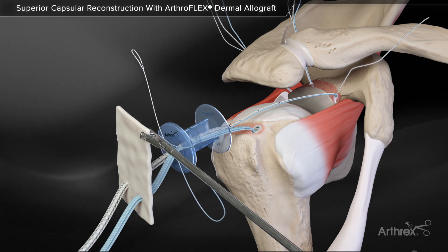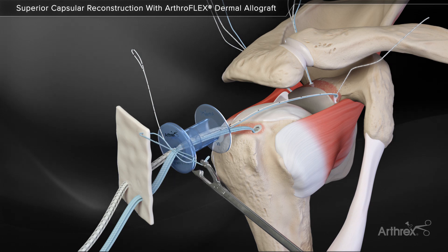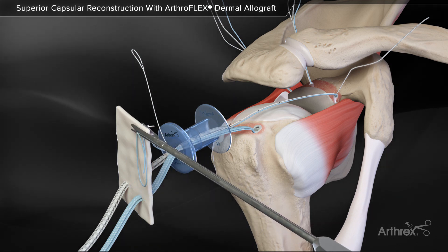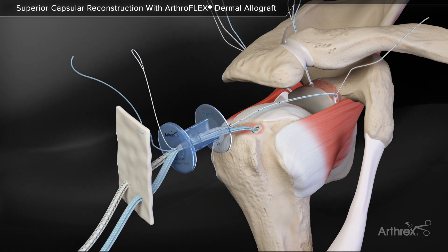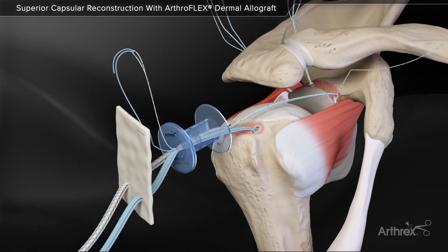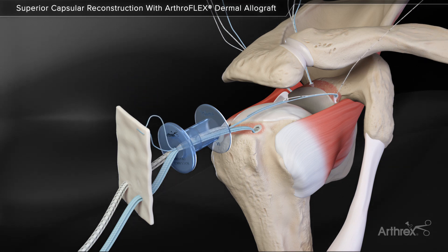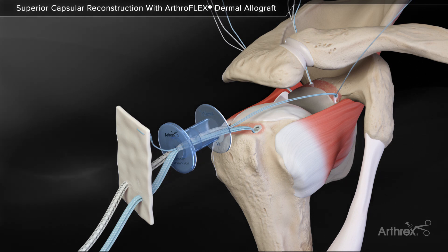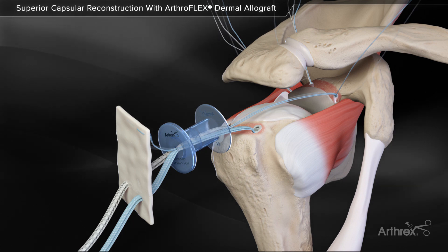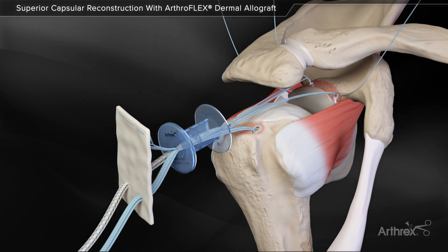The blue repair stitch is passed in a mattress configuration over its corresponding anchor position with a scorpion suture passer. The blue repair stitch is then inserted and folded through the white-black shuttle stitch loop. The opposing end of the shuttle stitch is pulled, retrieving the blue repair suture back through the anchor and out the corresponding percutaneous skin portal. Repeat this process for all three anchors.